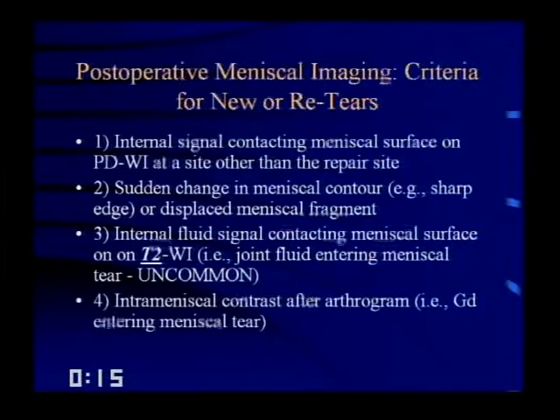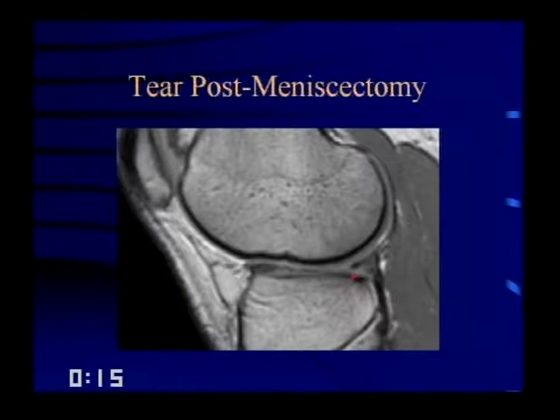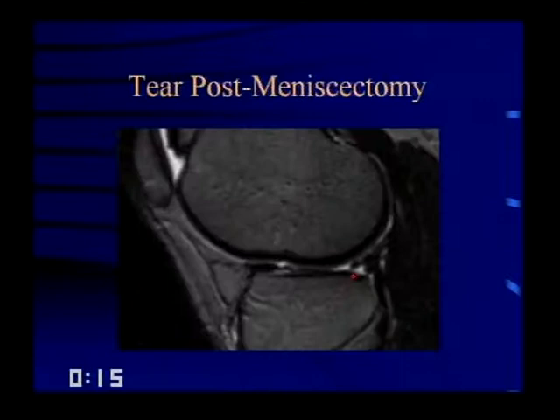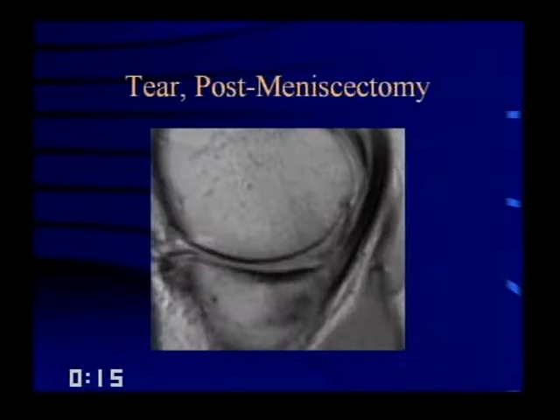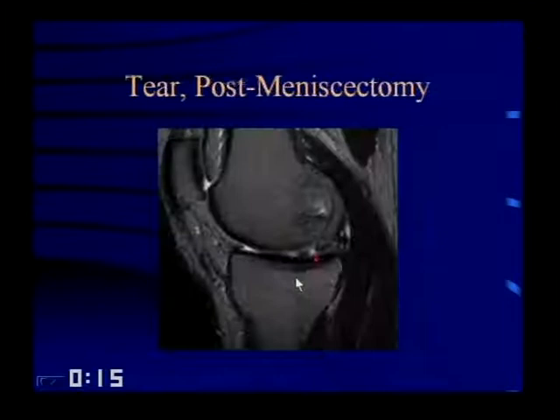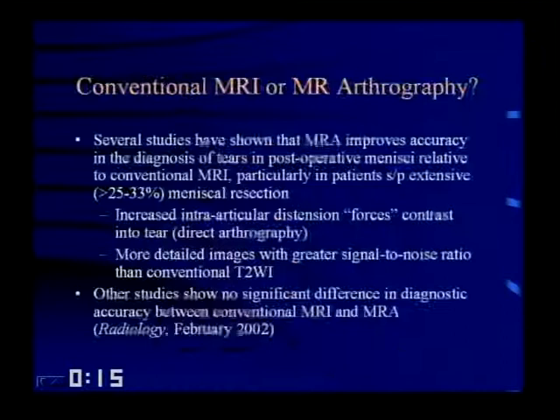Here's a post-meniscectomy case: there's a little signal abnormality in the posterior horn — is it a tear or healing tear? Looking at the T2-weighted image, there's fluid signal intensity going in there — that's abnormal, that's a true tear. Here's another: you can barely see the meniscus. On T2-weighted images, two fragments separated by a cleft of fluid signal intensity confirm a true tear. T2-weighted images are very useful in distinguishing true tears from degeneration.